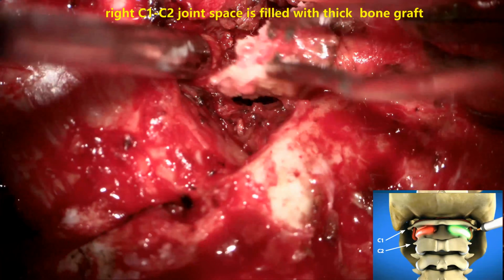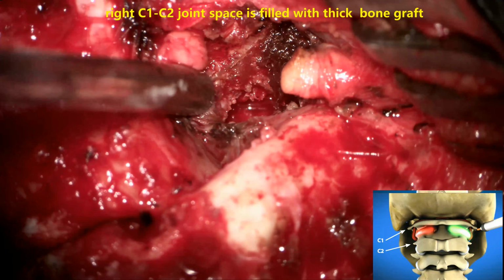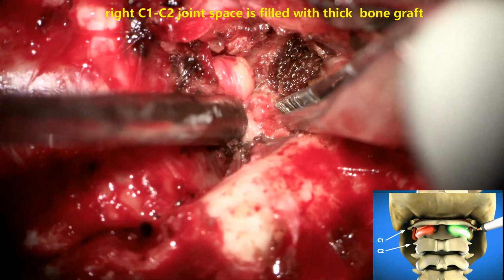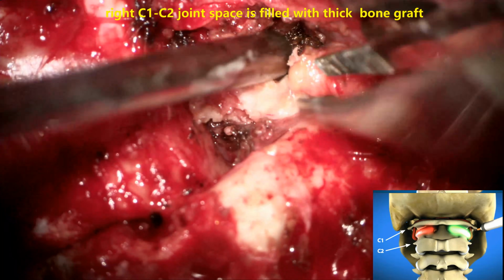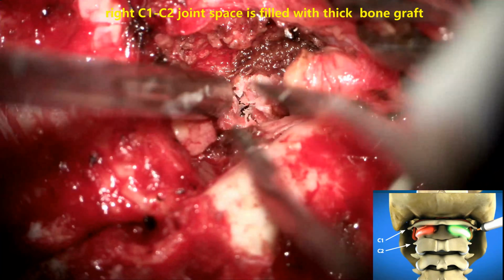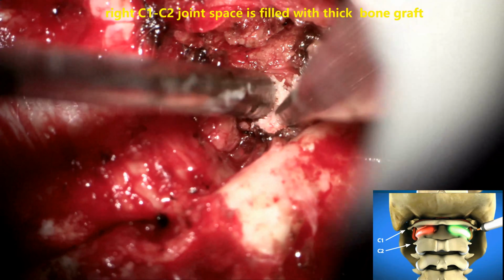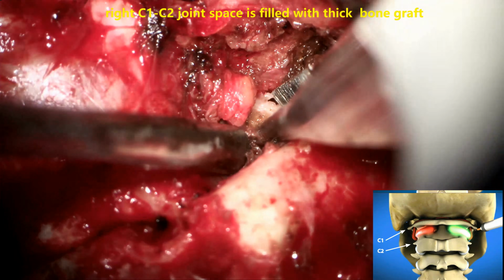Now the cartilage and the synovial membrane from the right side C1, C2 joint space are taken out. Here, the joint space between C1 and C2 is narrower because of the tilted asymmetric dislocation, where we need to put more graft into the right side so that this is elevated, and this helps in correction and in achieving the normal location of the cervical spine, and this helps in correcting the torticollis.